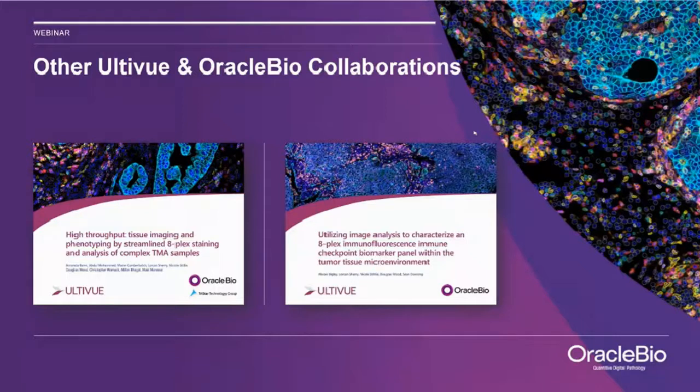Great, thank you. And someone's asked, how many slides can I stain in a workday? Well, I would say it depends on how long you want to work in a day, but we have a fully optimized protocol to run on a Bondrx, an auto stainer, which means that in 5.5 hours you can have 30 slides stained. So I would say the minimum would be 60 slides in a day because you can always run an overnight as well. If you are really a hard worker and you do 10 hours per day, you can go up to 90 slides in a workday.